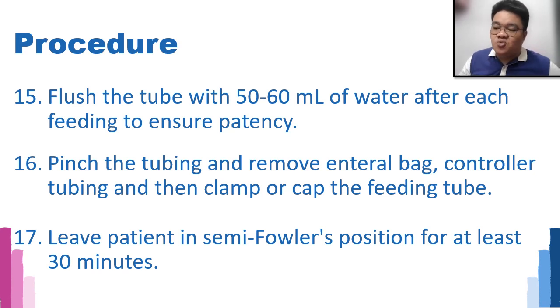patency of the tube. So again, for gastrostomy, we are not very worried of placement. We are worried of patency. Unlike in NGT, where our main concern will be placement over patency. In this case, our main concern is just patency.